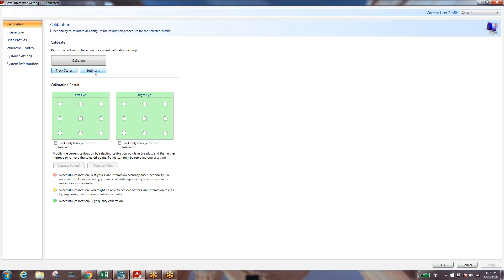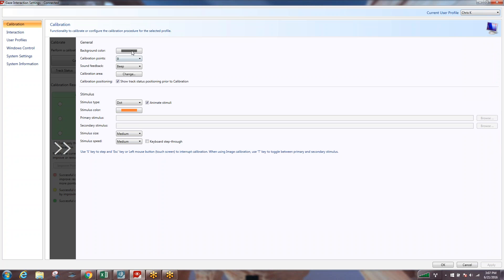If you have someone that you're trying to calibrate who you know is going to do pretty well — they're stable, they understand what they're going to be doing, and they have the ability to concentrate for the entire calibration — you probably don't need to change much in the settings. But if you go into settings, you can change the background color or change the number of calibration points.